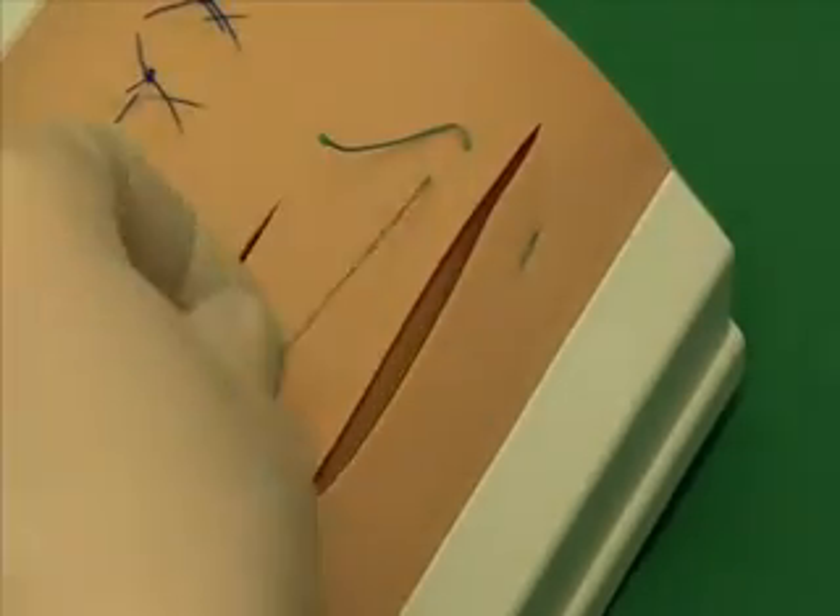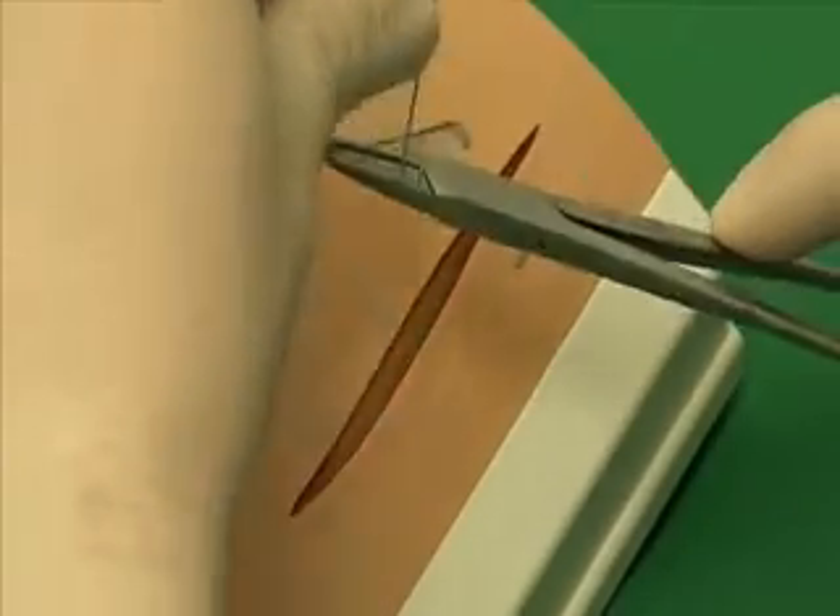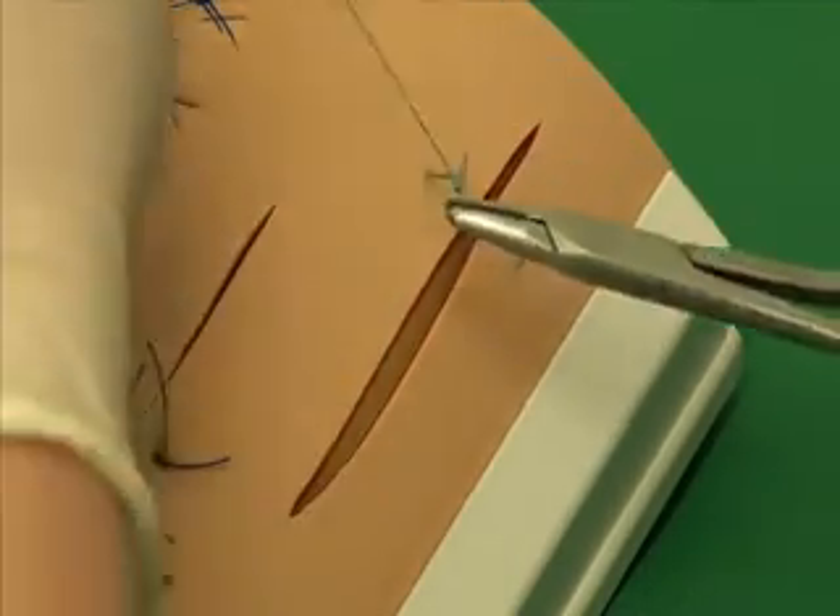The suture is then secured with an instrument knot across the open side of the U. With the first throw, the wound edges are opposed.